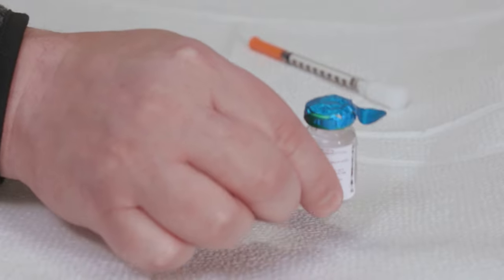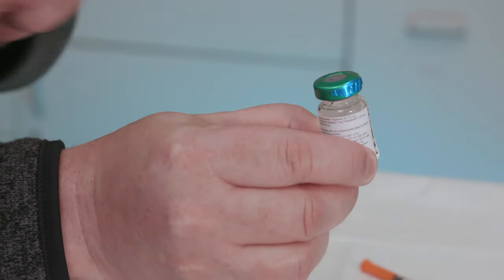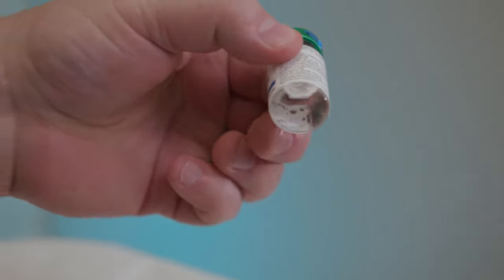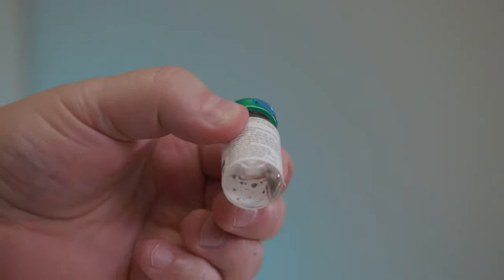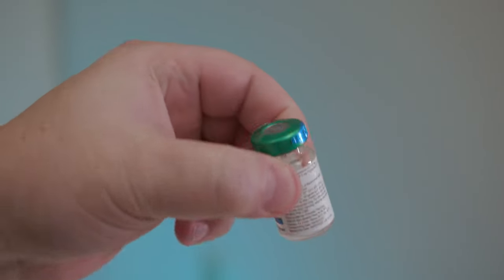If you're using the vial for the first time, take off the cap and throw it away. Be sure to check the medication in the vial. Don't use it if there is anything floating in it, if it's cloudy, or if the rubber stopper comes off the vial.